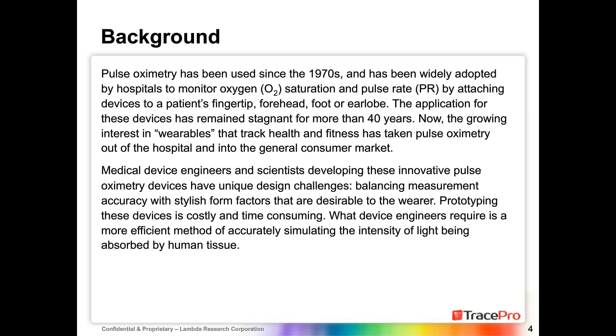How stylish is it? Who's going to wear it? When are they going to wear it? Are they going to wear it in direct sun? Are they going to be running a marathon with it? All of these things become a huge challenge for the engineer designing these devices. So we need a better way to be more efficient in our designing, and we need a better method of accurately simulating how light goes through these devices, gets absorbed by human tissue, and finally how the oxygen content gets out in some form that we can use accurately to display to the user.